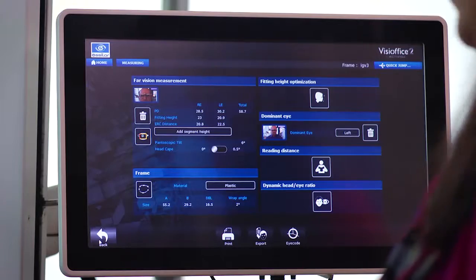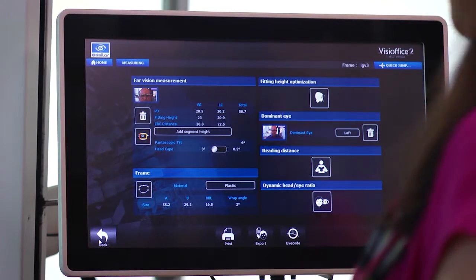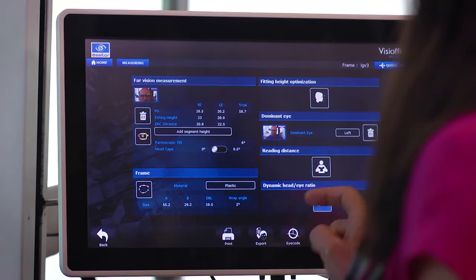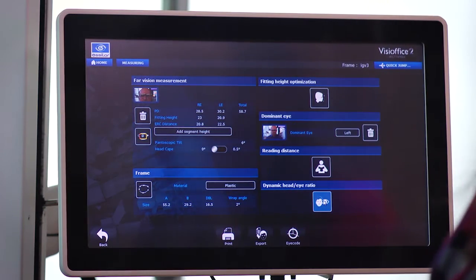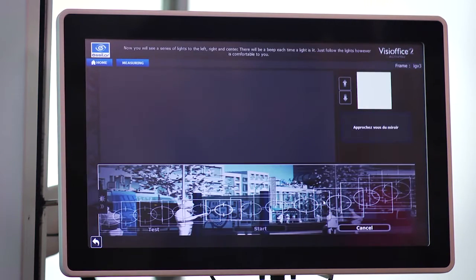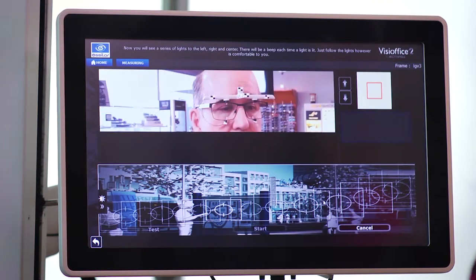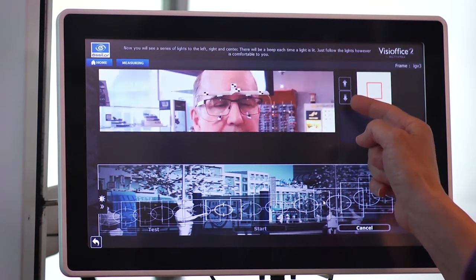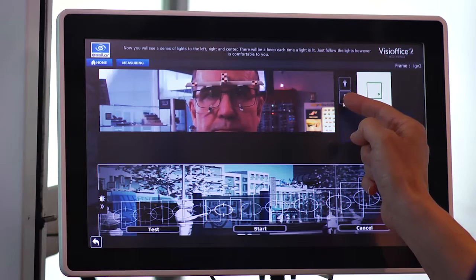Adjust the camera to bring the patient into view and confirm the dot is inside the box and both are green.